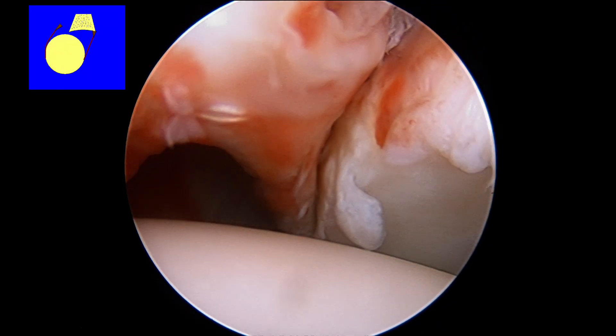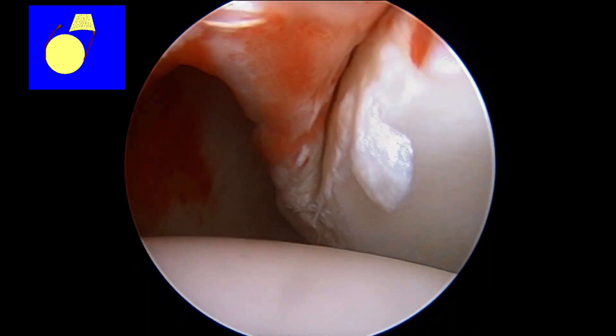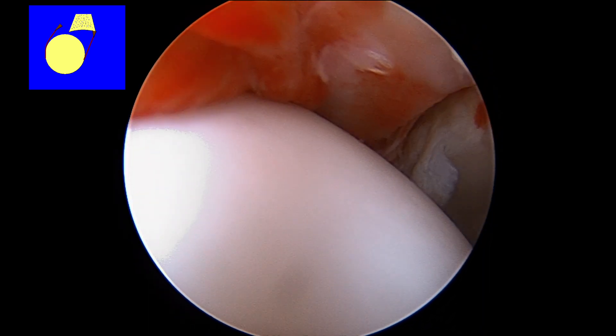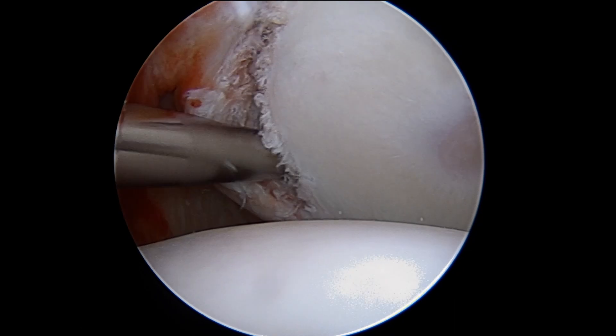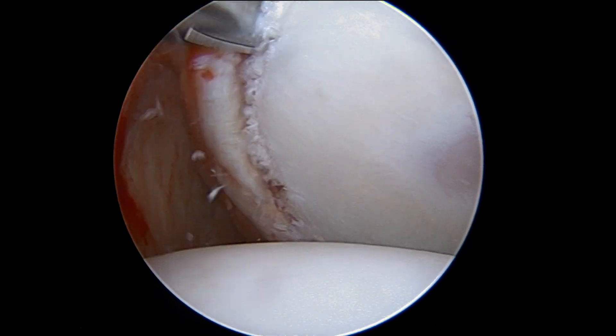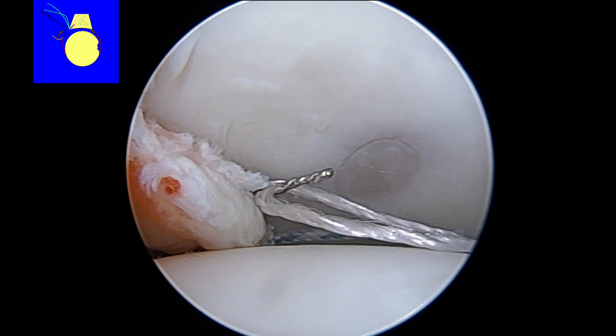Here we are at arthroscopy performing our examination under anesthesia. You can see as I apply an anterior force to the shoulder it easily dislocates. The first thing we're going to do is free up the labrum and ligamentous complex and abrade the bone back to bleeding bone to help promote healing.